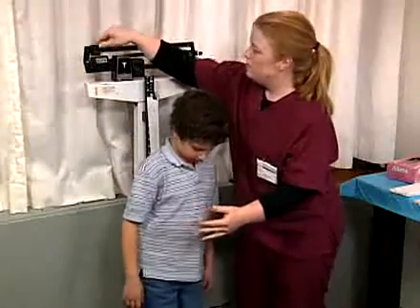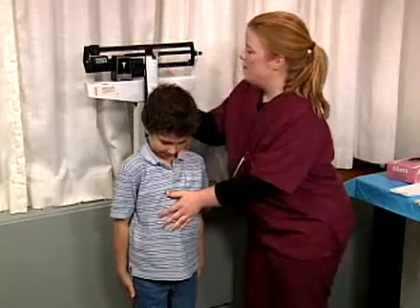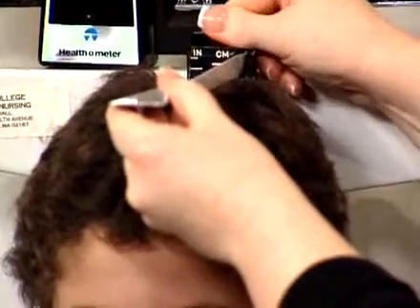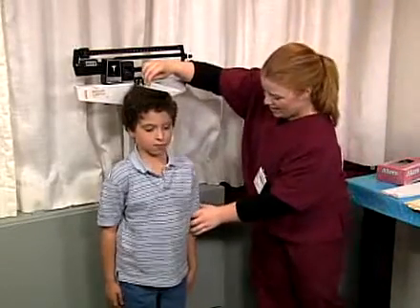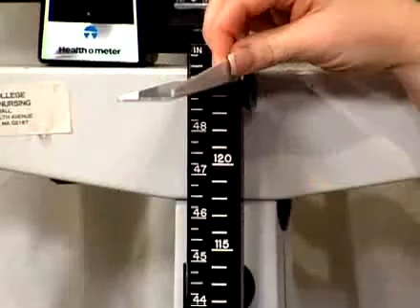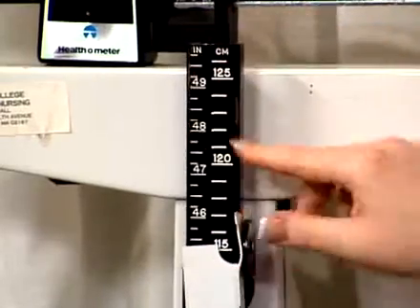To measure height, the patient is usually instructed to stand with the back to the height bar to prevent injury. Raise the sliding height bar well above the patient's head and open the horizontal measuring arm. Lower the sliding height bar until the horizontal measuring arm presses against the head, compressing the hair. Remember that numbers on the lower height bar go up to 50 inches, but the upper sliding bar scale reads down from the top. If the patient is taller than 50 inches, the height is read at the place where the top section moves away from the bottom section.